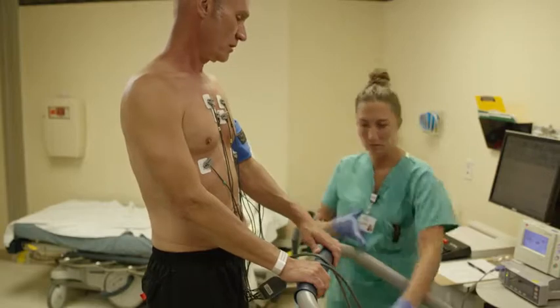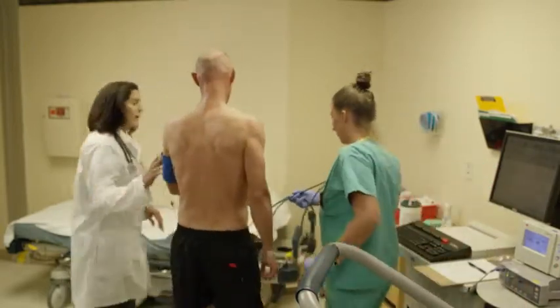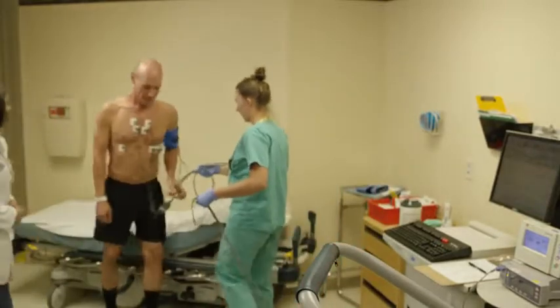Exercise stress tests are very safe, and your health care provider can quickly stop the test if you feel unwell or there's a problem.